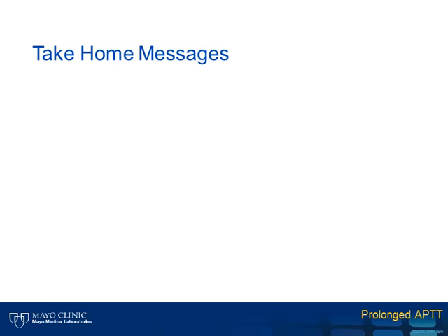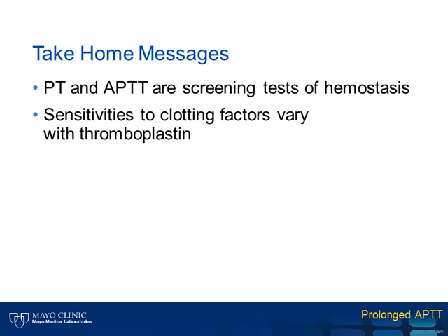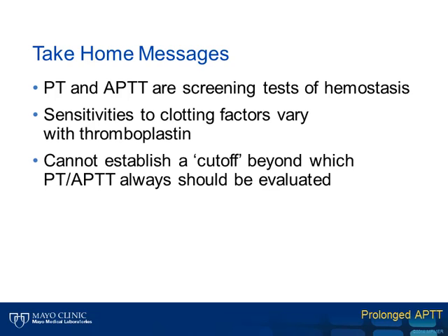So it is useful to consider the PT and APTT assays as screening tests. The sensitivities will vary, and one cannot establish a cutoff below which evaluation of a prolonged APTT would not need to be pursued. Interpretation of the abnormal assay should always take into context the patient medical history, medication use, and clinical presentation.